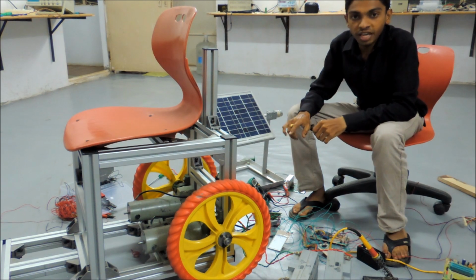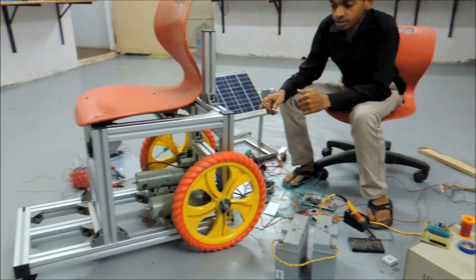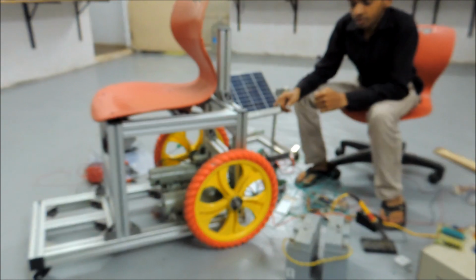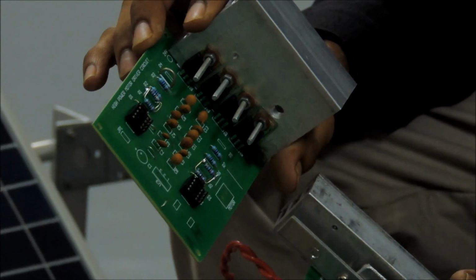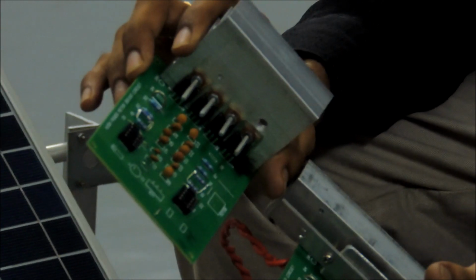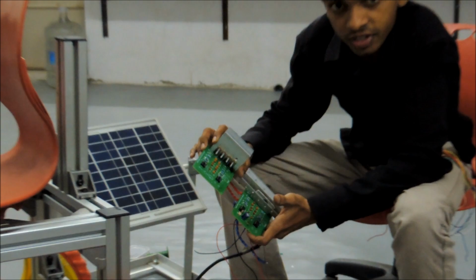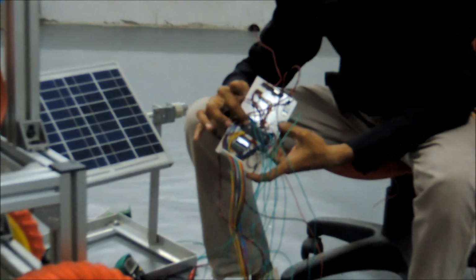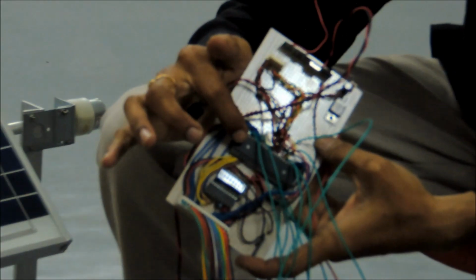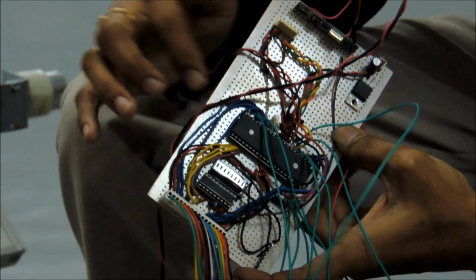Coming to the motors, we have used two PMDC type motors of 24 volts and 8 amps, which are capable of carrying 100 kg. To drive the motors, we have implemented two high power MOSFET drivers, with two IR2101 ICs and 4 IRFZ44N MOSFETs. Coming to the main board explanation, we mainly have an ATmega32 microcontroller, and we burn the code into an AVR ATmega microcontroller.